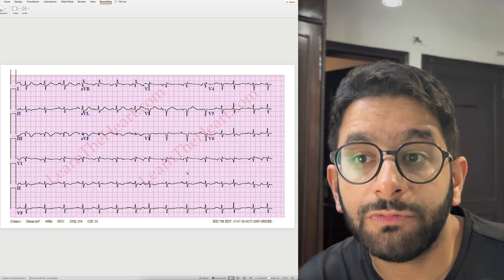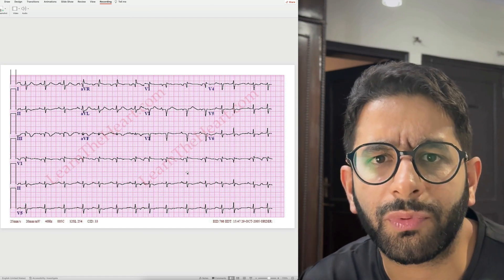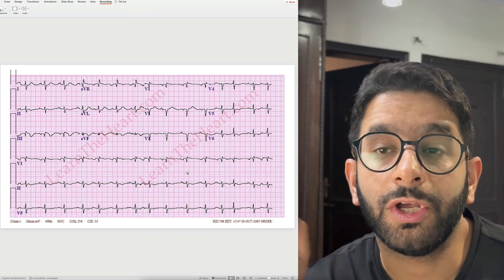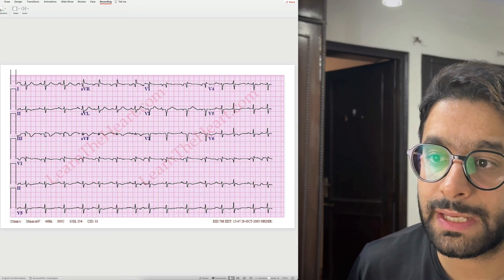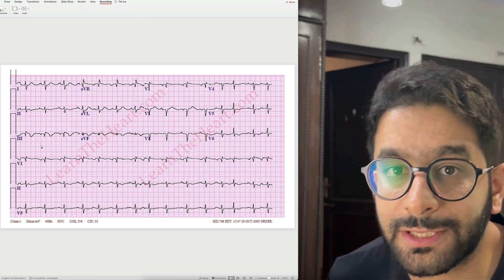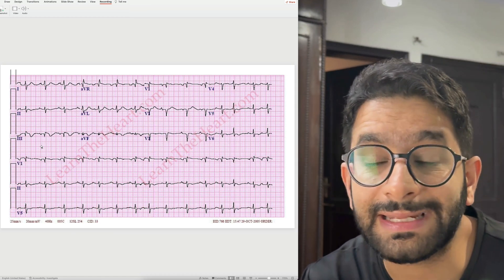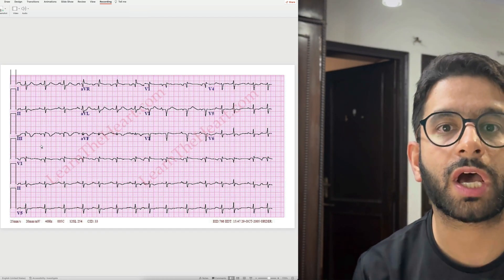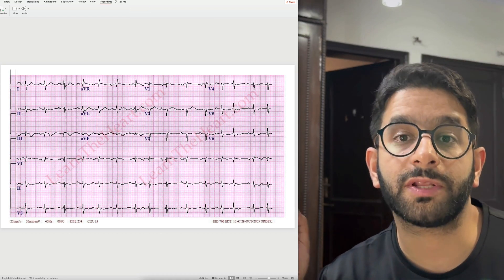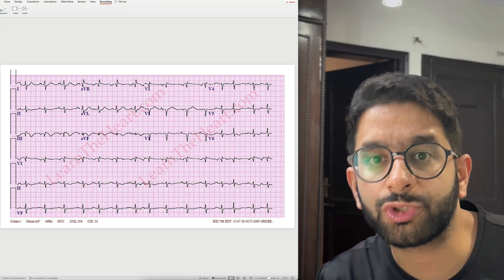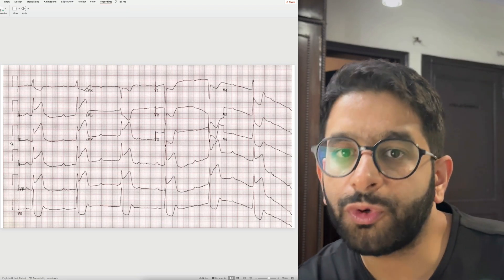Another ECG that's not so easy to recognize but in a given context you should actively look for: somebody with a history of prolonged immobilization who suddenly crashes with dyspnea and hypotension and you suspect pulmonary embolism — look for the S1Q3T3 sign: deep S waves in lead I, Q waves in lead III, and T inversion in lead III. This is present in maybe 10 to 20 percent of acute PE cases but is very specific for acute RV strain. The most common ECG feature of PE is actually sinus tachycardia.